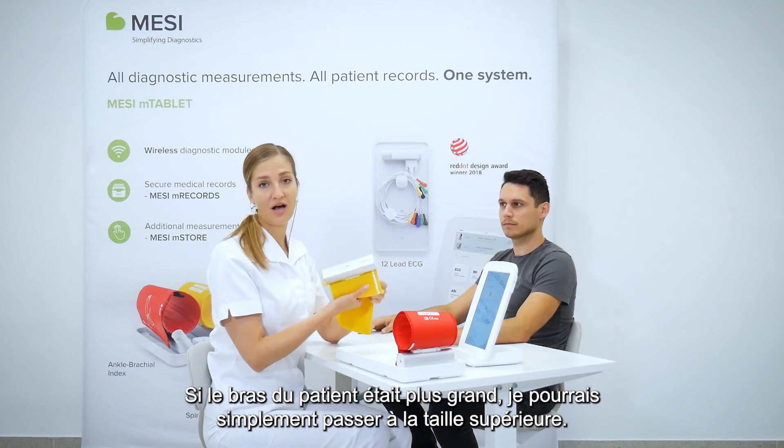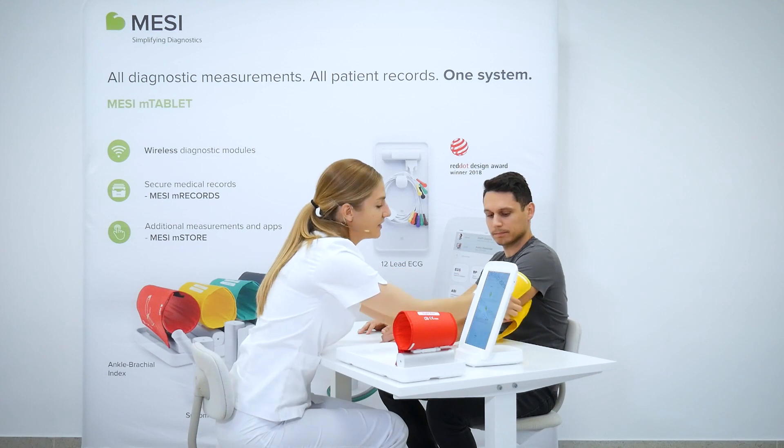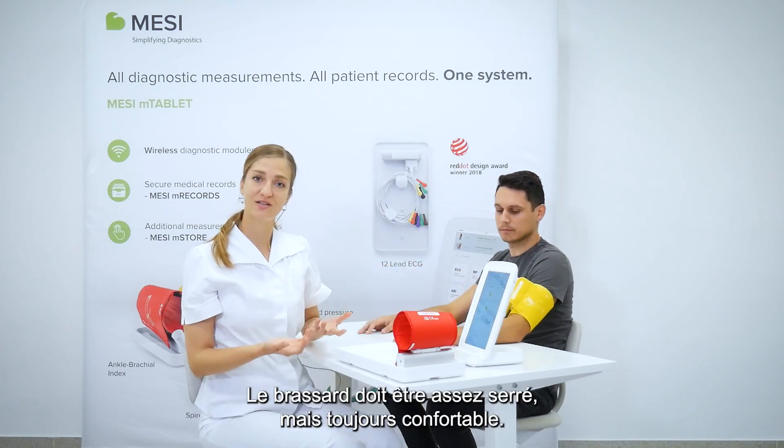If the patient's arm would be bigger, I could simply switch to a large sized cuff. The cuff should be pretty tight, but the patient should still feel comfortable.